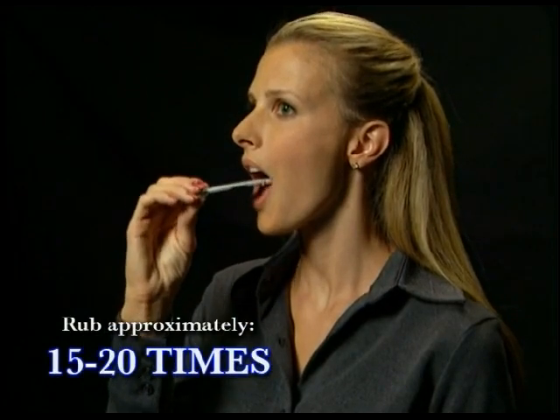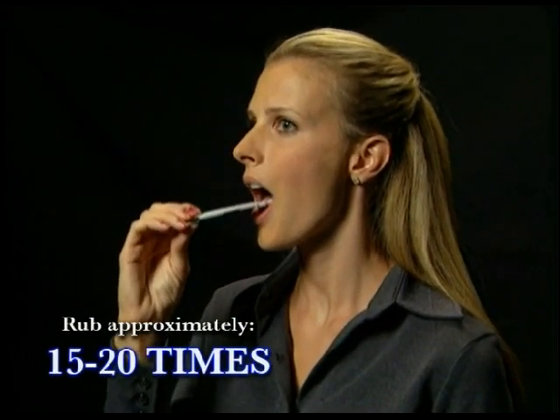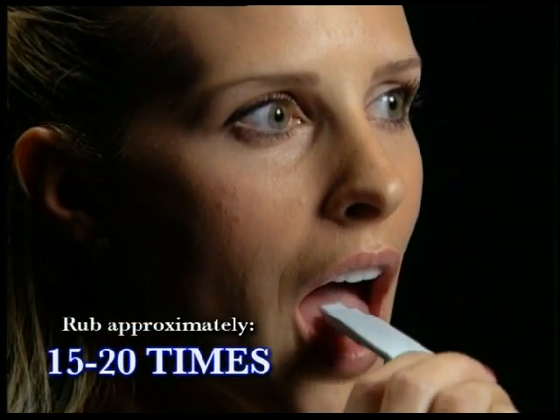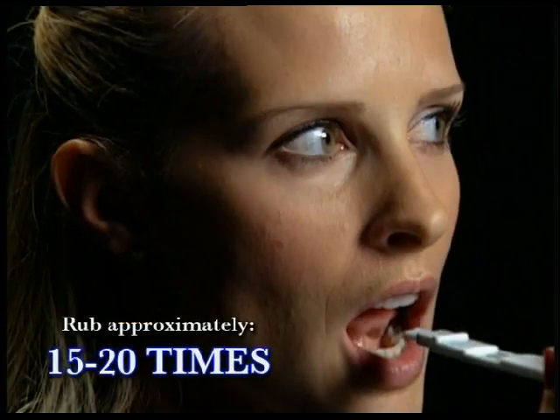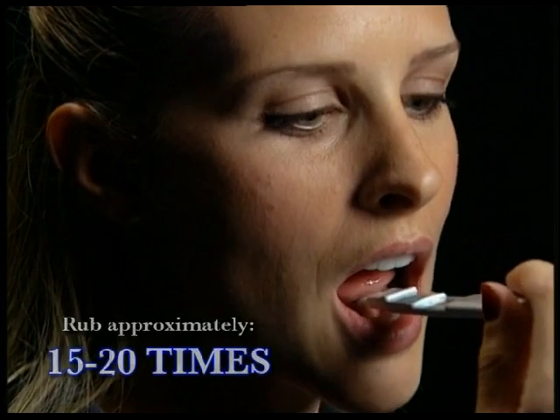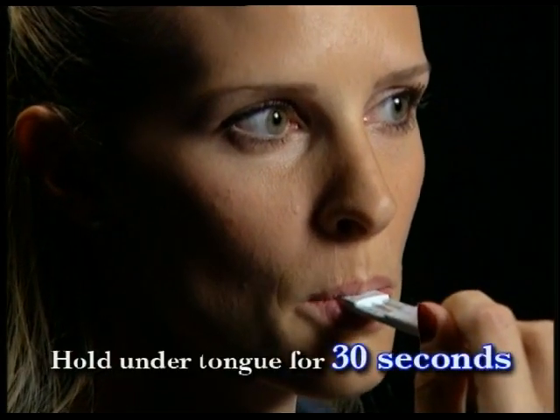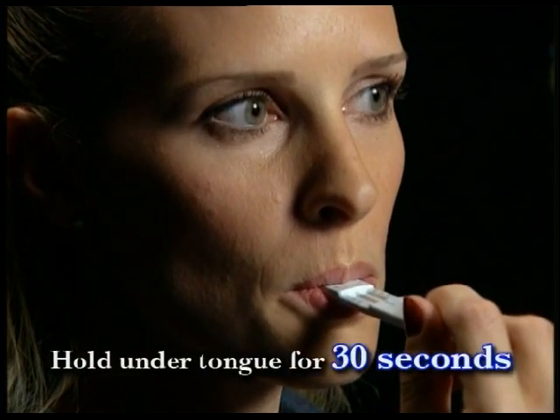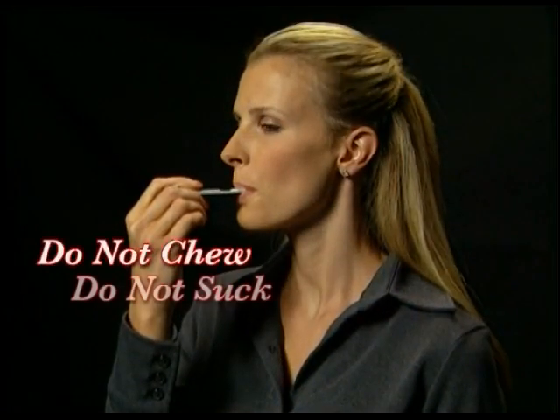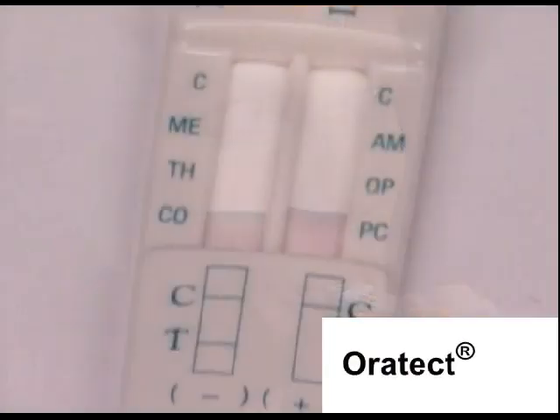Instruct the donor to now turn the collection pad downward and gently rub several times on the top of their tongue. Afterward, instruct the donor to turn the collection pad facing upward and gently rub several times underneath their tongue. Finally, instruct the donor to keep the device level and hold the collection pad under their tongue for 30 seconds to collect saliva. Advise the donor not to chew, suck, bite, or bend the collection pad at any time.